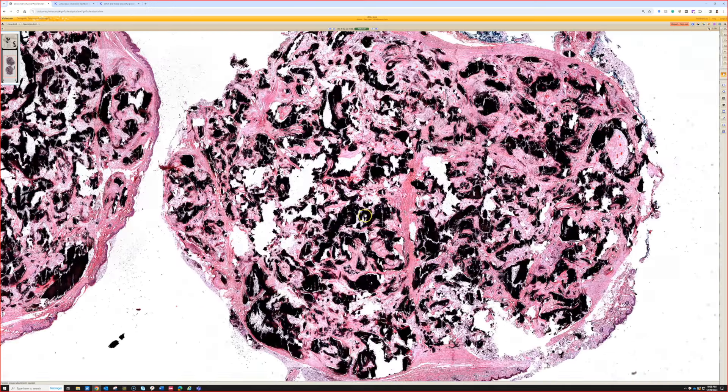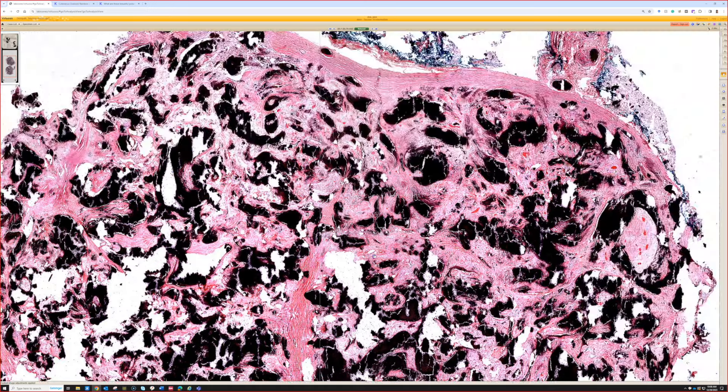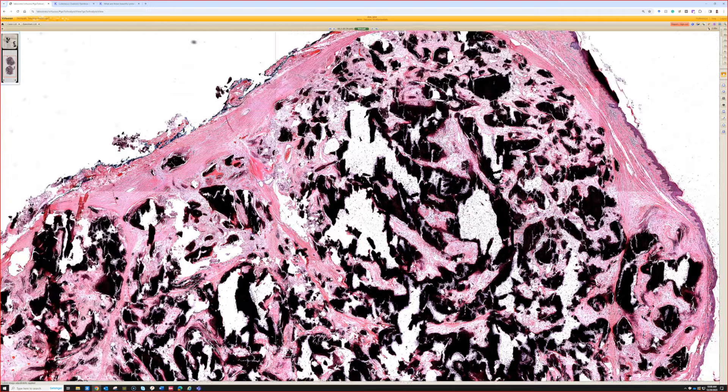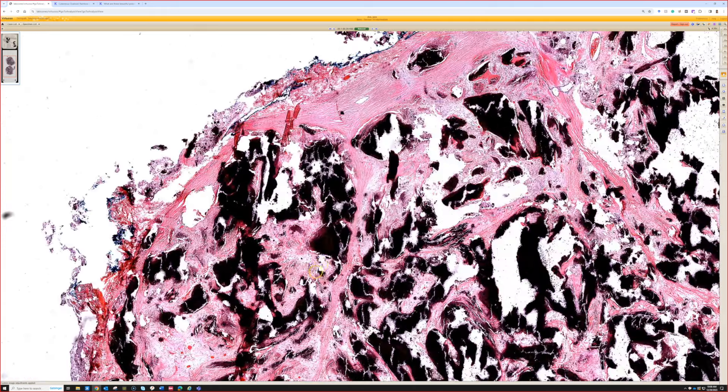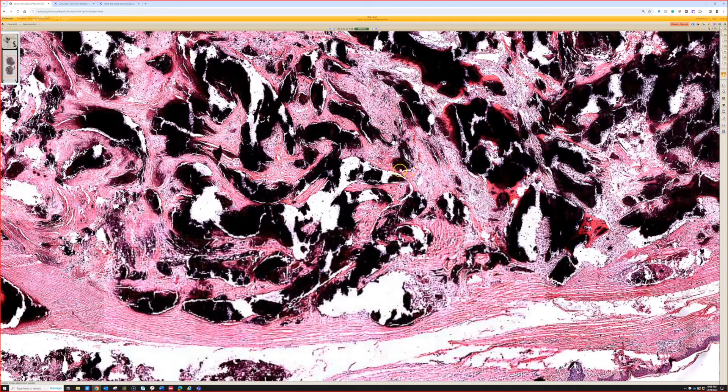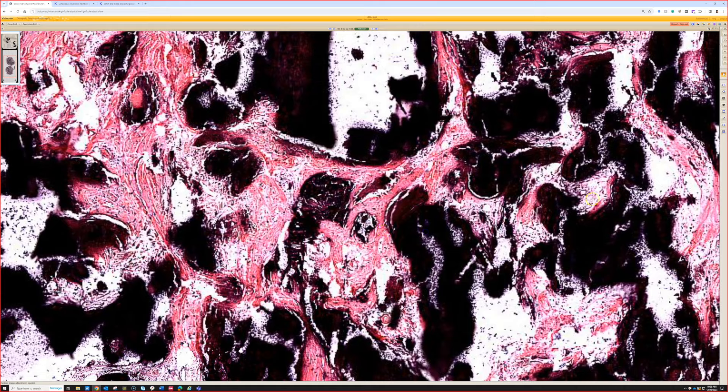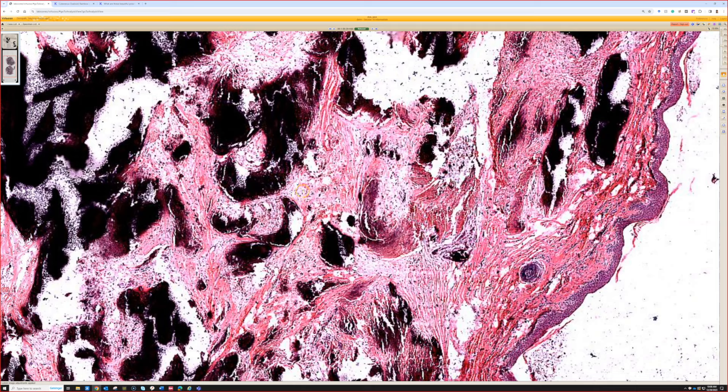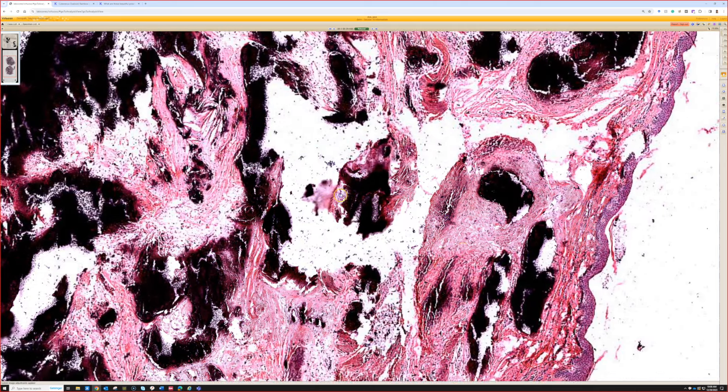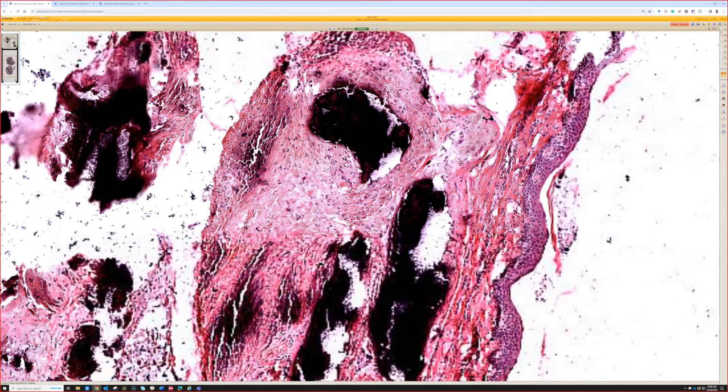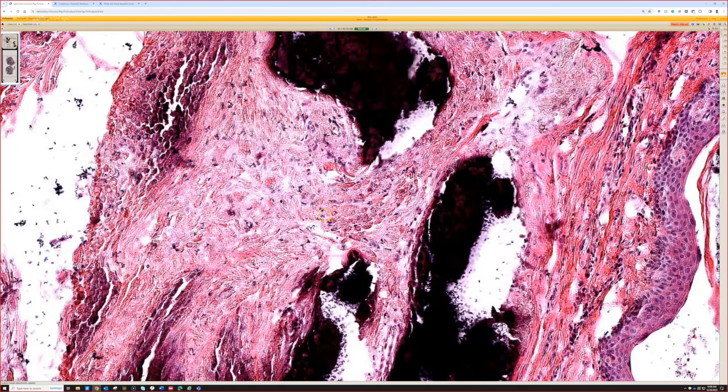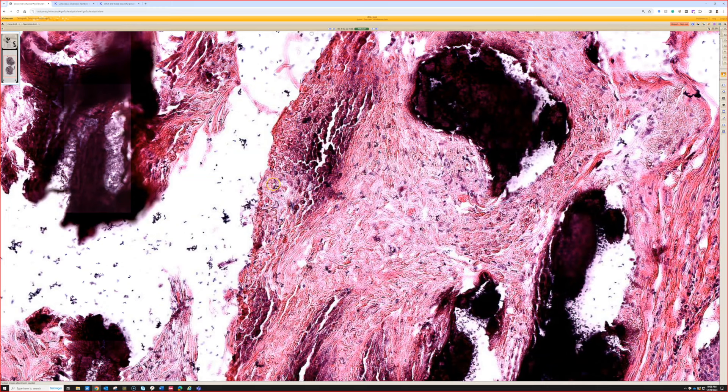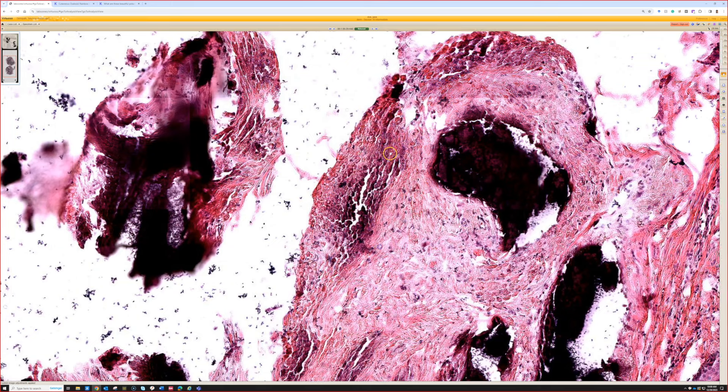And when we look closer though, let me find the area. Very tricky in this case because it's pretty focal. But you can see here as this comes into view, gosh it's a little out of focus. Sometimes calcified things are kind of thicker on the cut and so it's hard to get them to scan well because they're out of focus a little bit, but here you can see it.